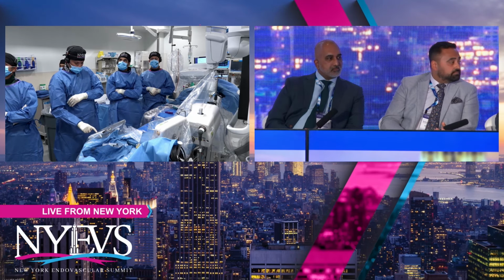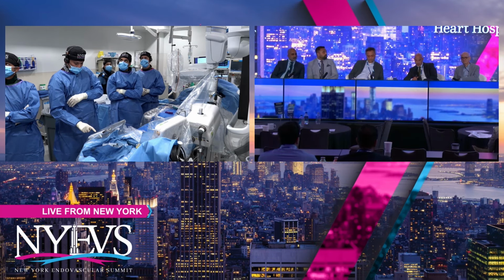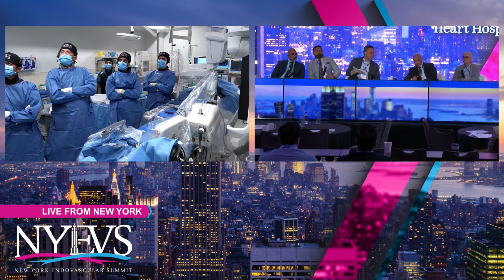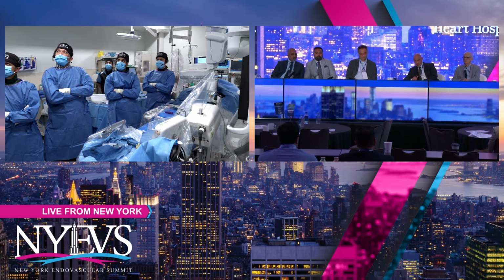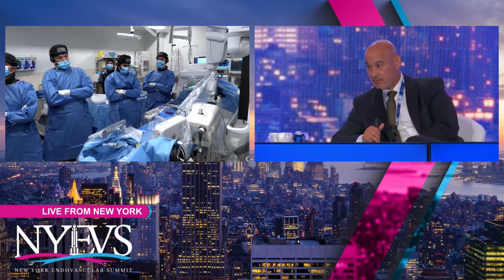I think the most important part of this procedure is that they had placed already a distal embolic protection. Regardless whether the wire flies down or it does not, having a filter in a long segment ISR is important. Otherwise, you pay for it dearly.